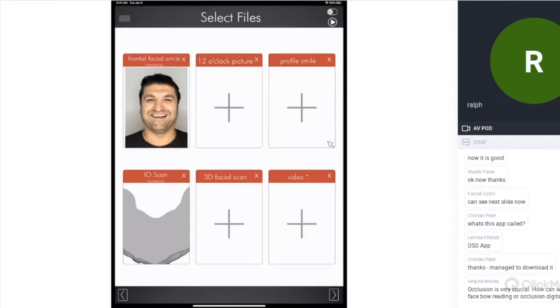So we're going to have first lower design, and I work on some very, very unique technologies for you to record the video interview of the patient, and we're going to simulate the jaw movements in the app based on the video interview. You don't need different devices just to have the real movement of the patient and then to check the occlusion. Right now, we are going to just design, just aesthetics.